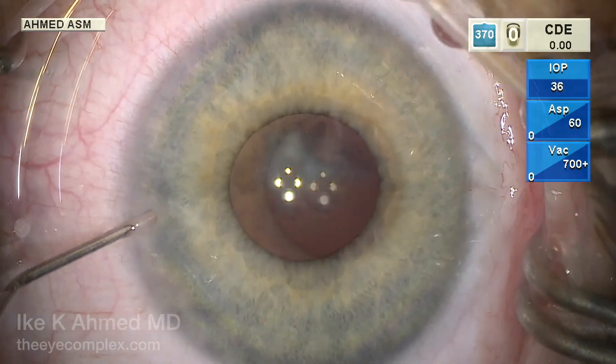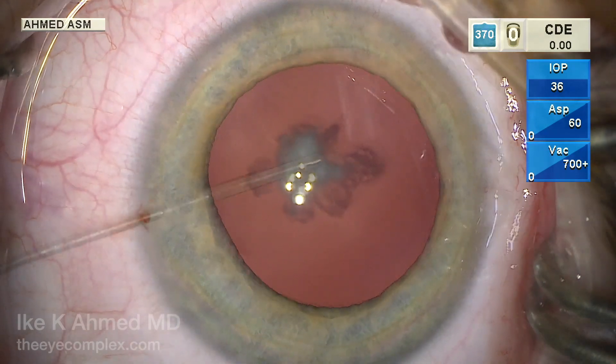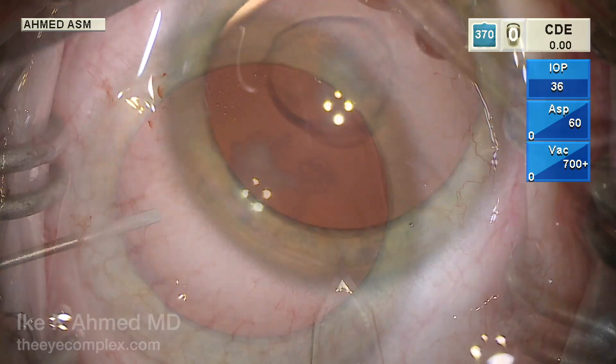This is a congenital posterior polar cataract in a three-year-old presenting. We start off with some xylocaine and phenylephrine to dilate the pupil intraoperatively, and then some dispersive viscoelastic.